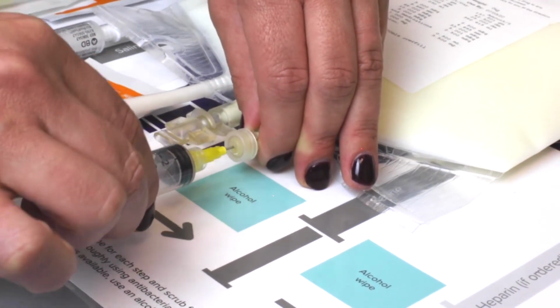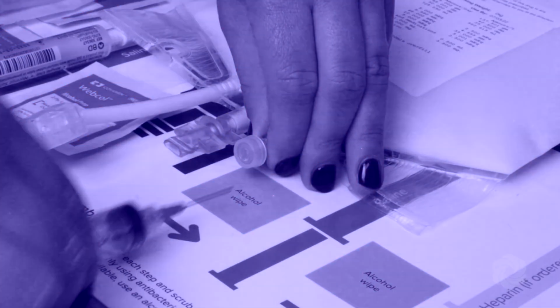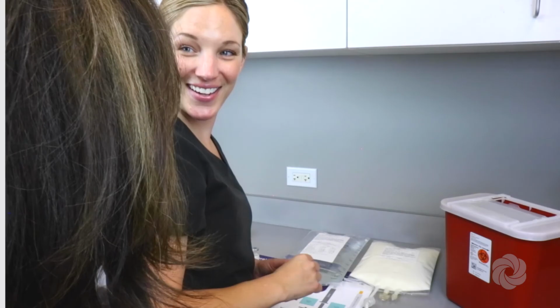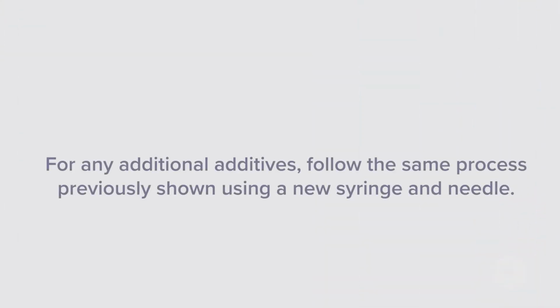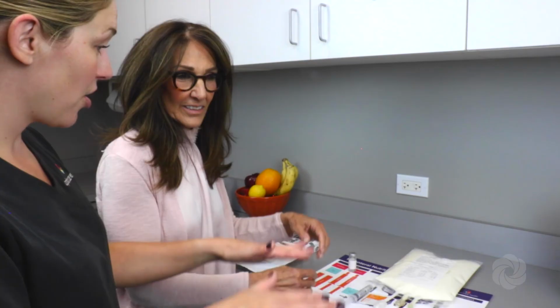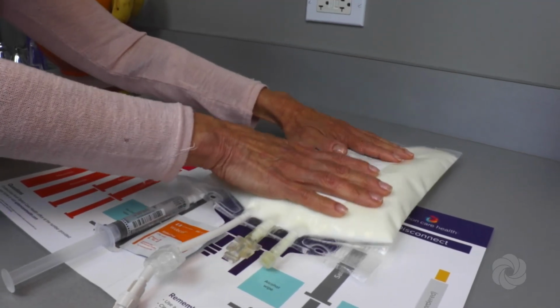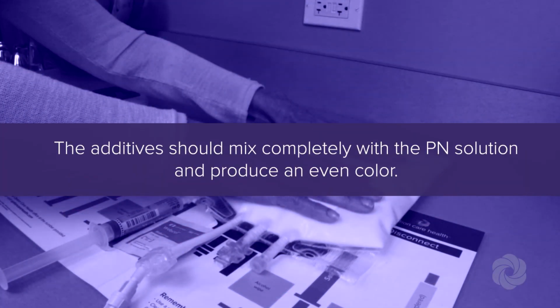Remove the syringe and do not recap the needle. Dispose of the used syringe and needle into the sharps container. For any additional additives, follow the same process previously shown using a new syringe and needle. Once all additives have been added to the PN bag, gently rotate the bag in order to mix the additives into the PN solution. The additive should mix completely with the PN solution and produce an even color.